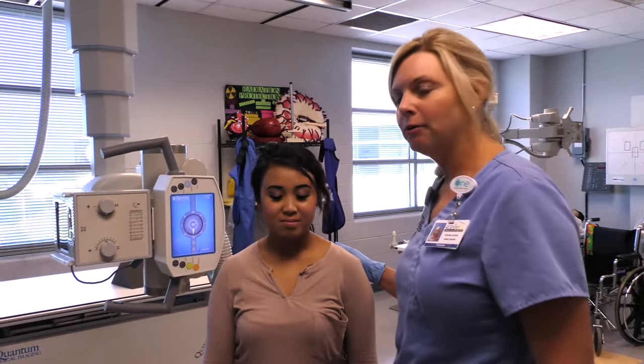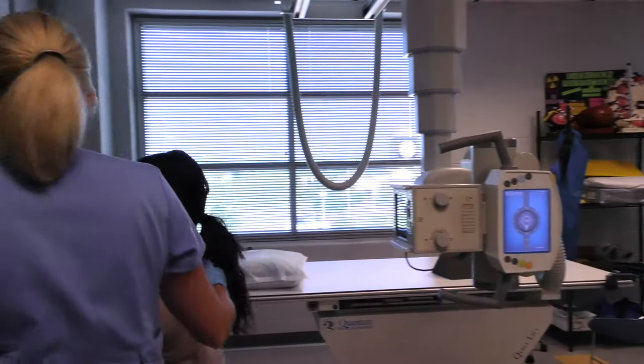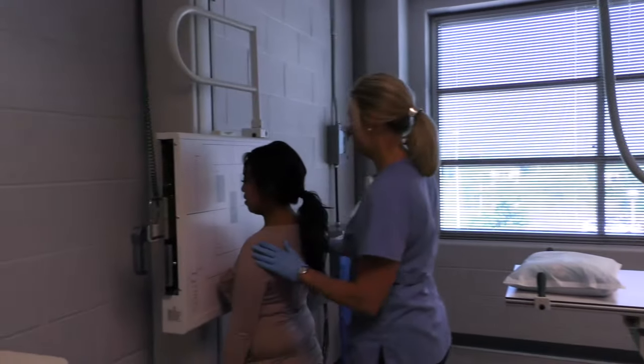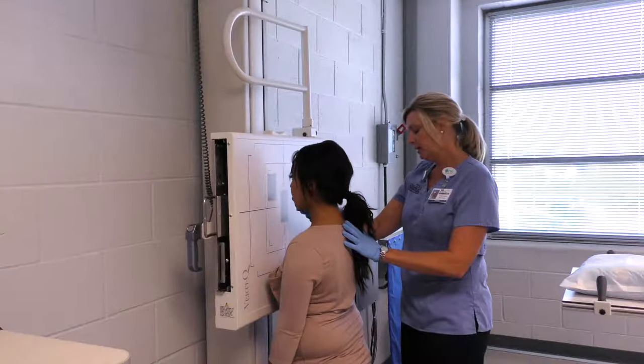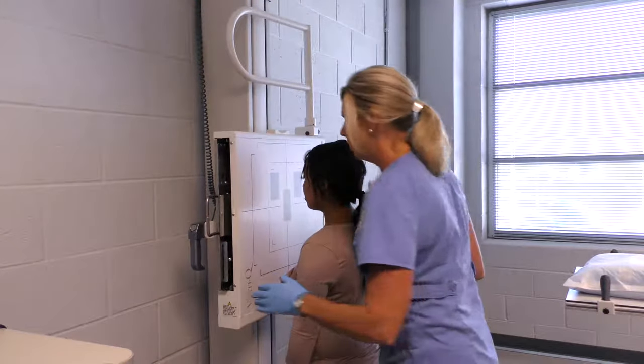Alright, we're going to start out with the PA and lateral chest. Vanessa, if you're going to stand right in front of the board. Alright, lift your chin and spread your feet apart. We want your feet and your weight evenly distributed.